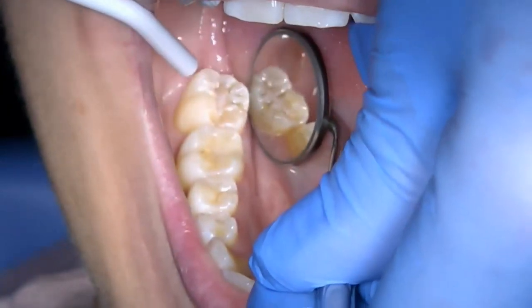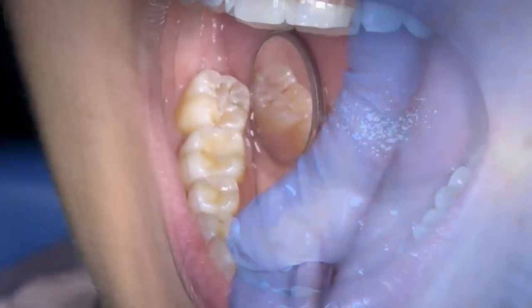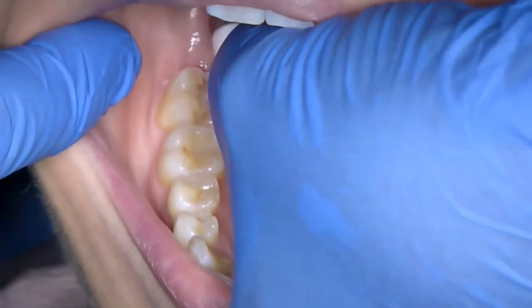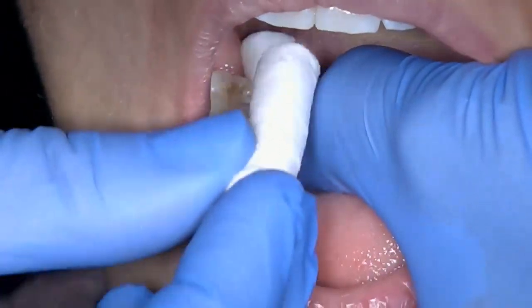The fissures were cleaned using a slow speed handpiece and dry bristle brush, then inspected to ensure they are free from debris. Cotton wool rolls are placed lingually and buccally to isolate the tooth, and then the tooth is dried again.